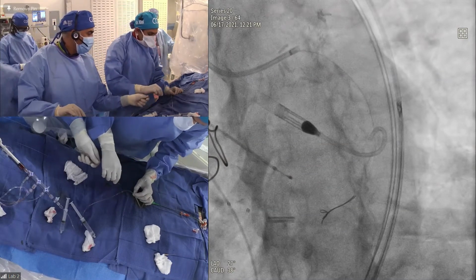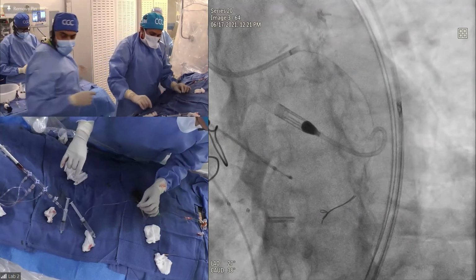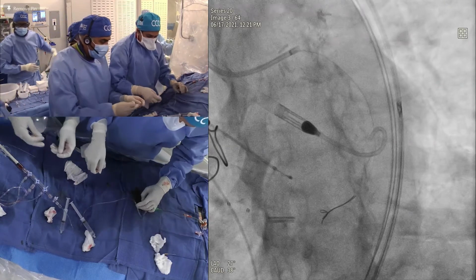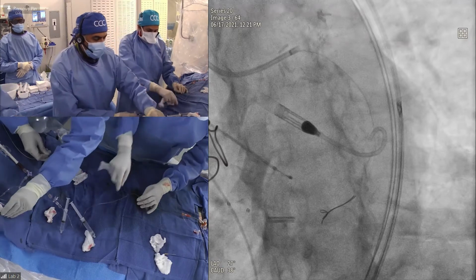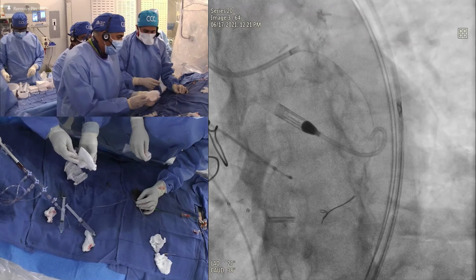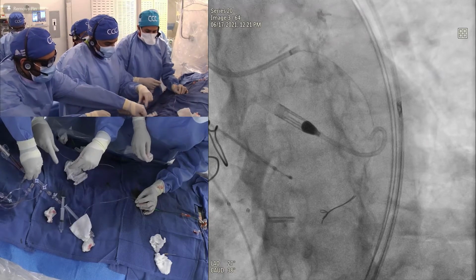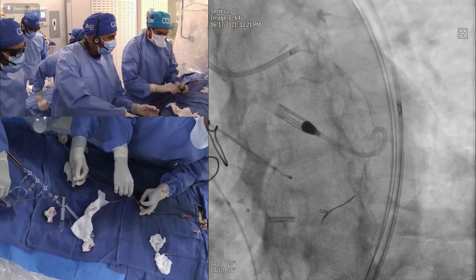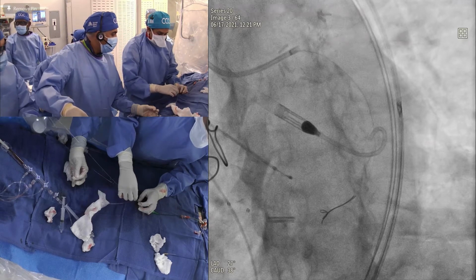Roxana, one important point in this case is why we did not go to a larger burr. I hope we made that very clear. Once we saw the 1.25 burr dissection, the other question was, when the balloon wasn't going, could you have come in with the rotor burr past the dissection and just do a little bit of distal ablation? But it looks like you were able to finally open it with the balloon, and now you're going to stent it and it should come out okay.